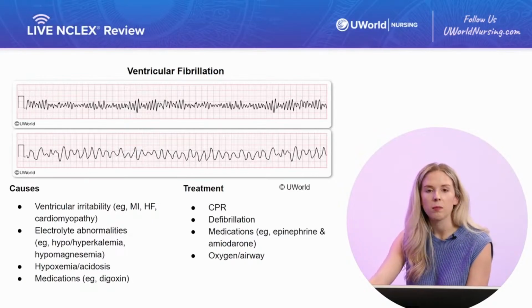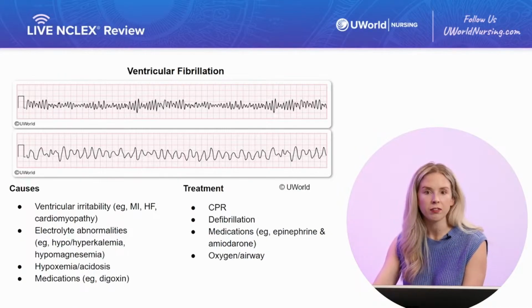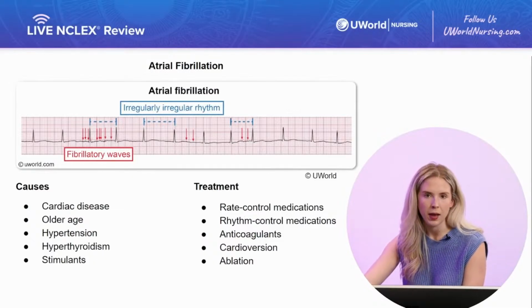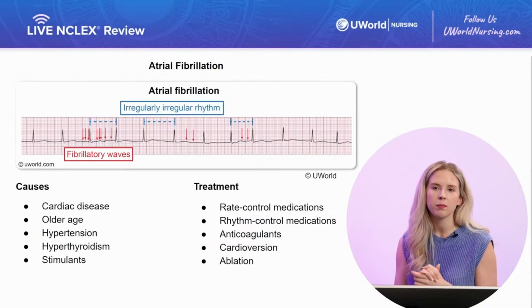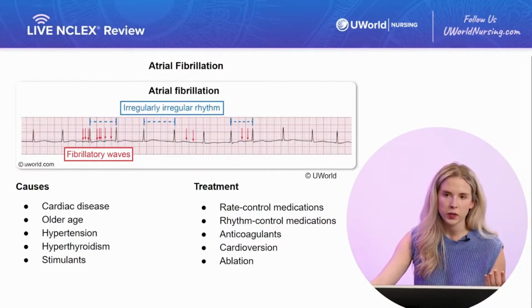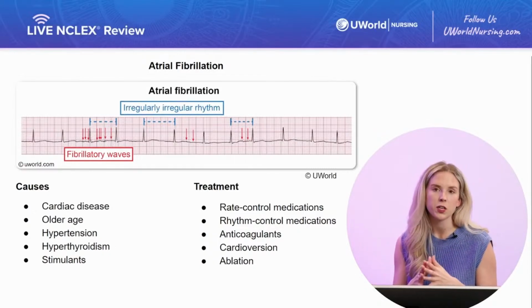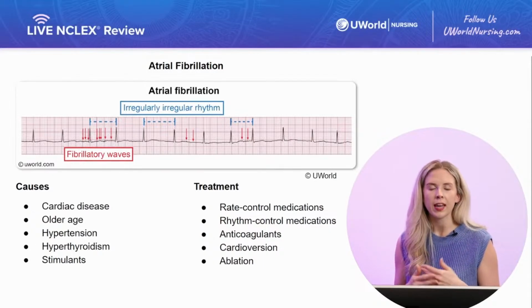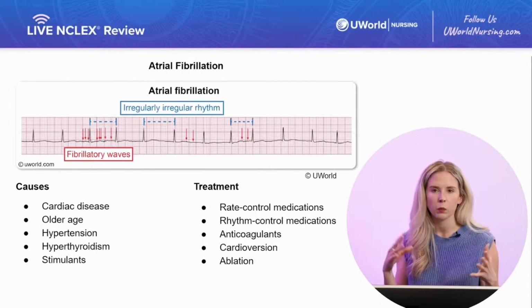So now we are up to our final dysrhythmia of the day, and that is going to be AFib. So this is a really, really common dysrhythmia. A lot of people live asymptomatically with this. In AFib, the name really says it all. It is atrial fibrillation. So our atria are glitchy, our signals are not coordinated, they're weak, and our atria are moving independently of one another.